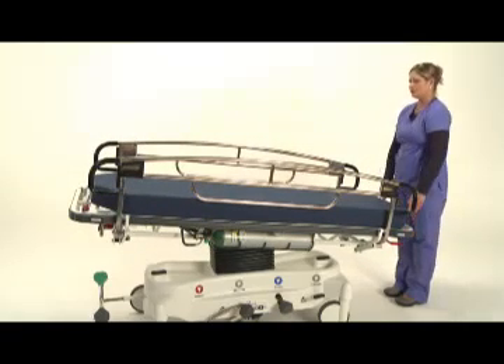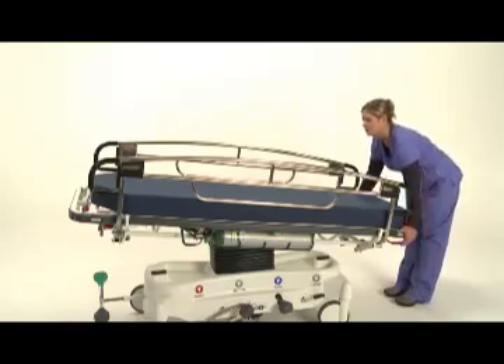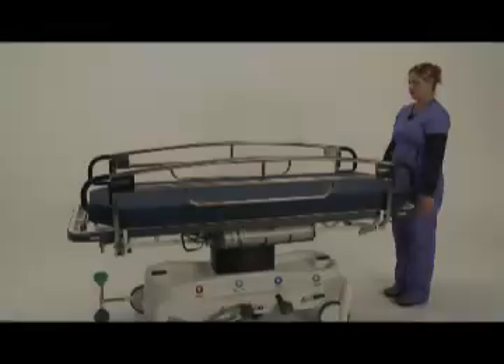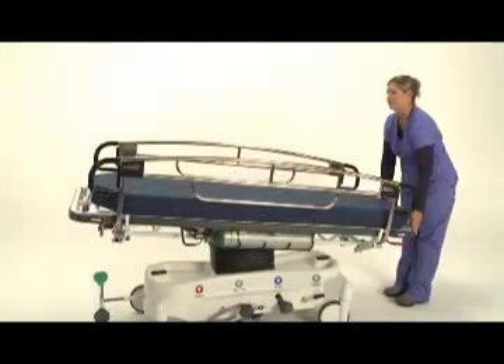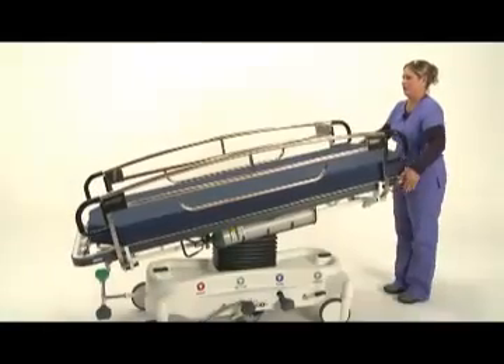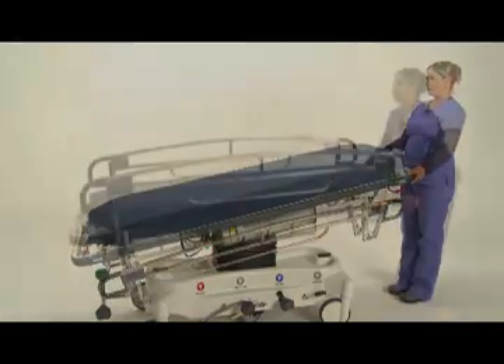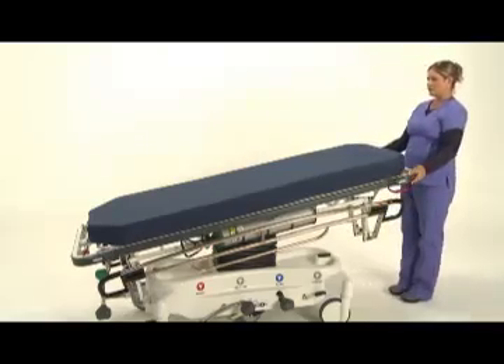To return the litter top to the horizontal position, squeeze the red lever and lift upwards until a click is heard and release. Pedego's hand operation for both Trendelenburg and reverse Trendelenburg is intuitive and facilitates in the positioning of the patient. In a code situation, the patient can quickly and easily be placed at the desired angle. Release each side rail and have full access in a matter of seconds.